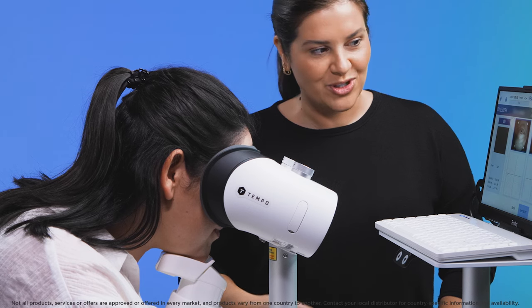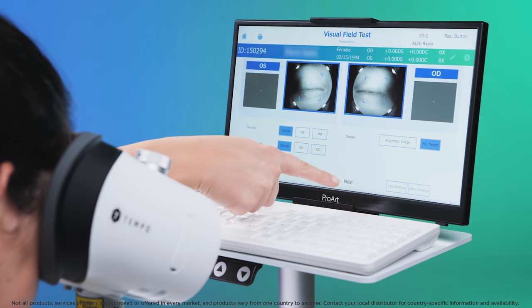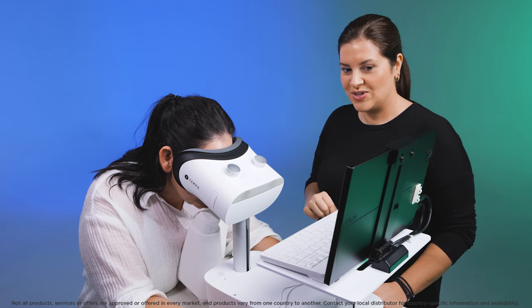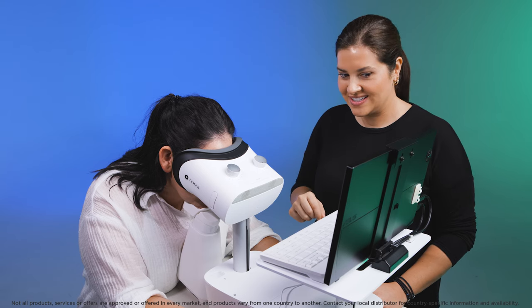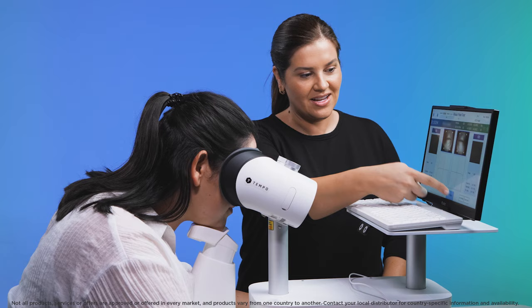Direct the patient to keep looking straight ahead at the alignment image and press next. Check with the patient to make sure they see the fixation as a single cross and not double. Then start the test by clicking test start. The test begins after a countdown from three to one.